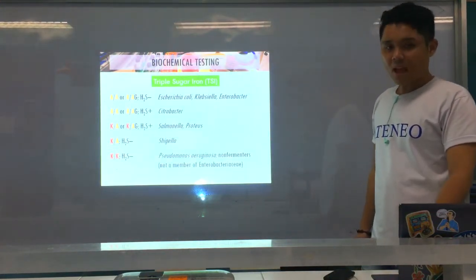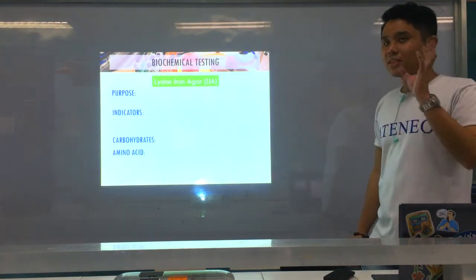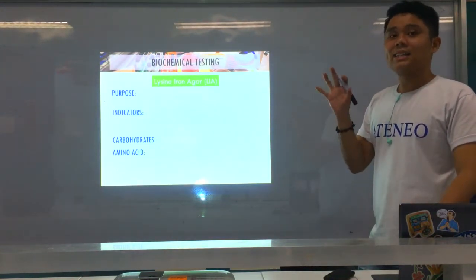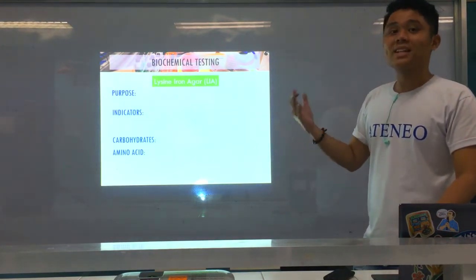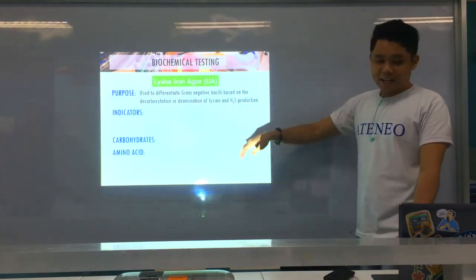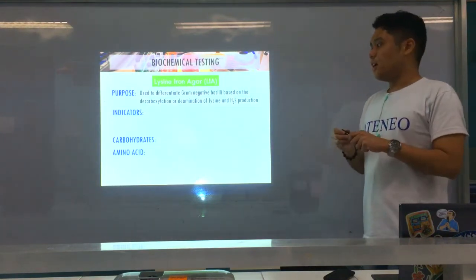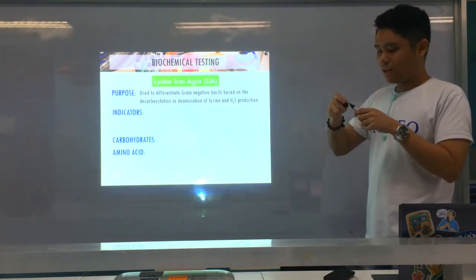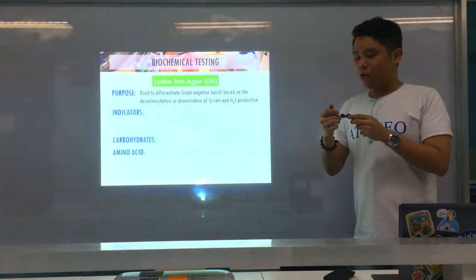Pseudomonas aeruginosa, again, is a non-fermenter, not a member of the Enterobacteriaceae. Now, next, we go to the LIA, lysine iron agar. Actually, LIA has the same principle in a way as TSI, but what is detected or utilized by the bacteria is different. For lysine iron agar, it is still a butt and slant, but it is based on the decarboxylation and deamination of the protein, of lysine.